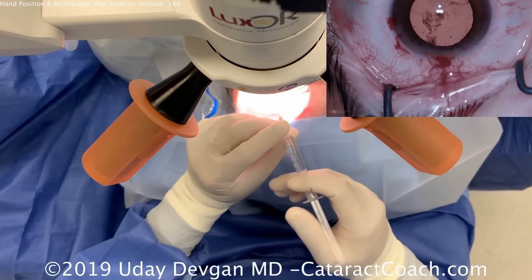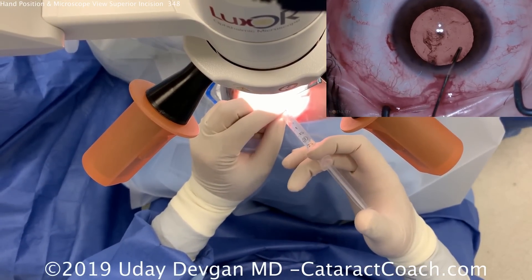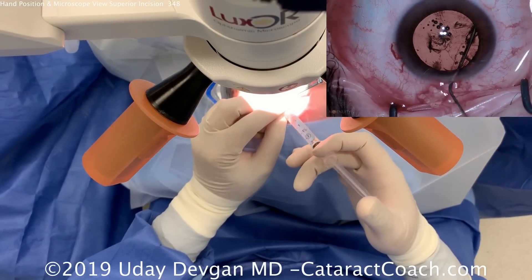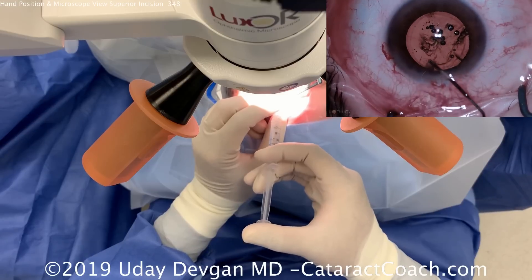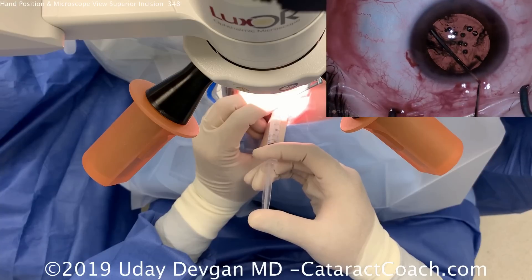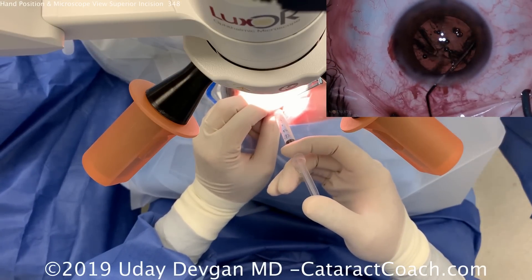Now for balanced salt solution for the hydrodissection. The left hand is holding the tip of the instrument — we hold the cannula tip to make sure it doesn't fly off inadvertently. The right hand is on the plunger. Look at the pivoting to go to different meridians and make sure we get that nice fluid wave. We'll do plenty of hydrodissection to really free up this nucleus.